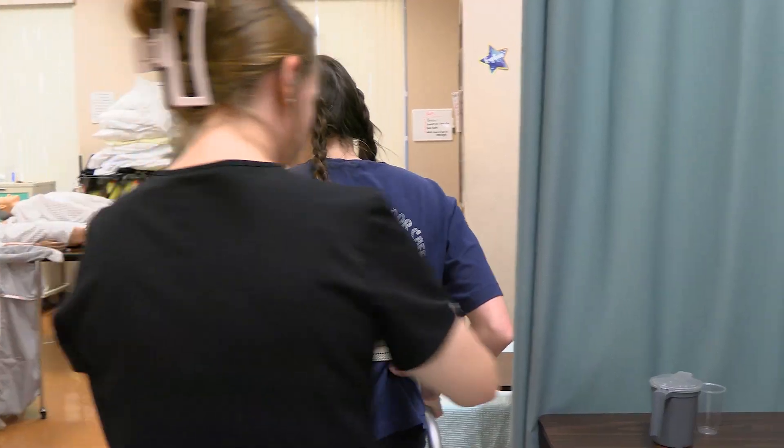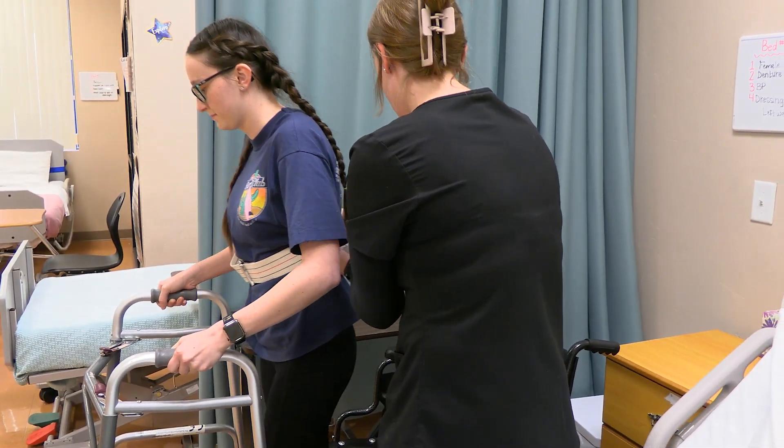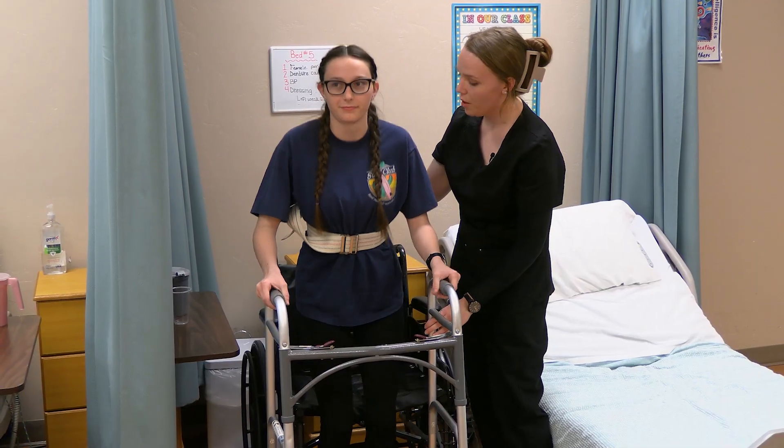Alright, we can start to turn. And then please take a step back. Do you feel the wheelchair behind your legs? Okay, we may now sit on the count of three. One, two, three.